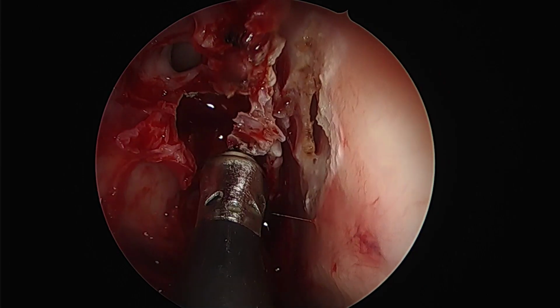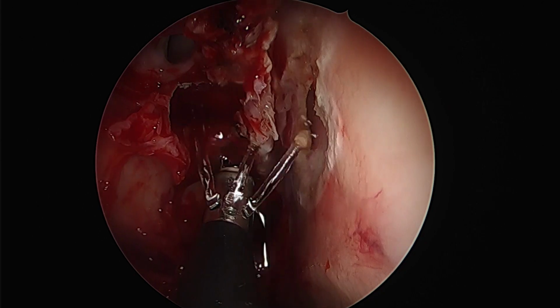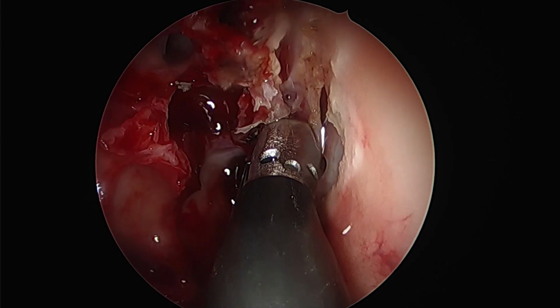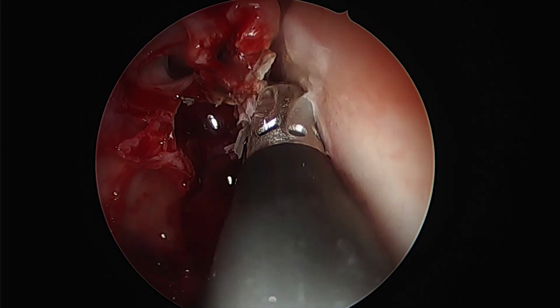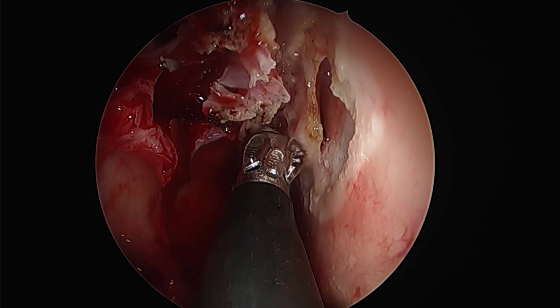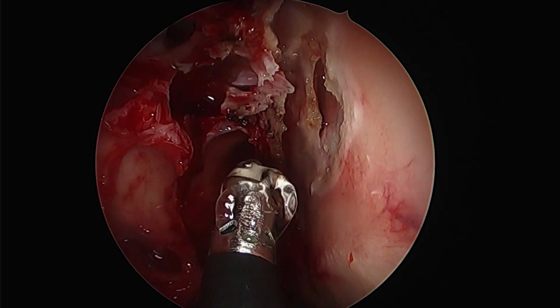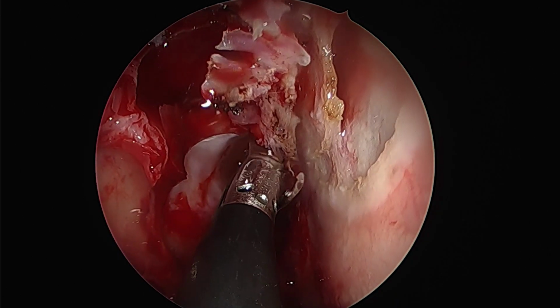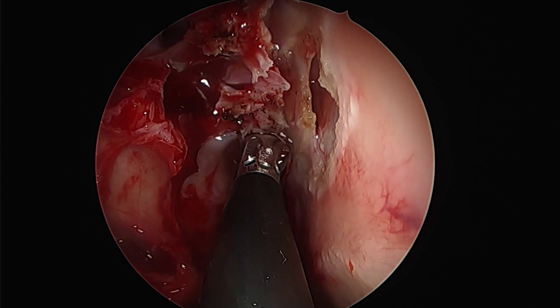Now we are using a coblation wand. This is the ProSize Max plasma ablation wand from ArthroCare. So this is a wonderful tool for ablating the mucosa over the site of defect. So we can see here that some bit of the cartilage has been taken down, and we can see on the other side the mucosal flap is intact. This is a wonderful tool to achieve not only hemostasis but to also ablate the mucosa around the defect.